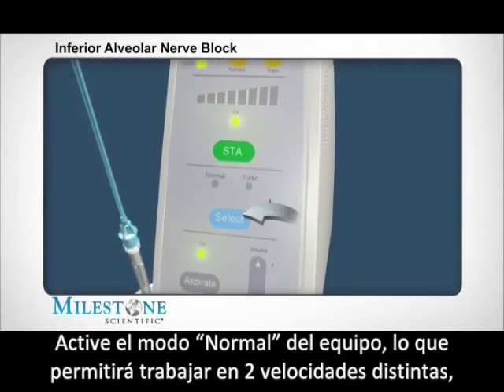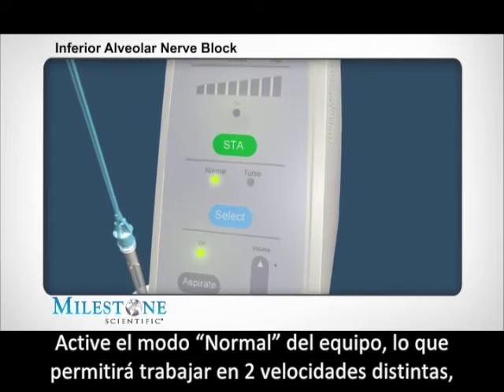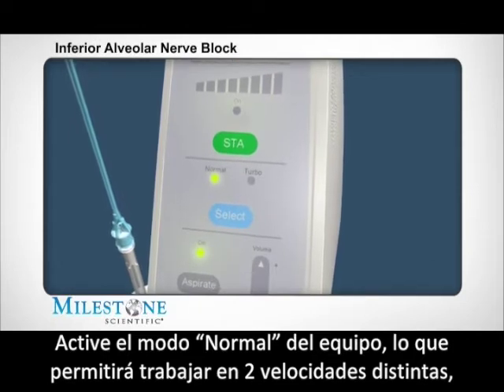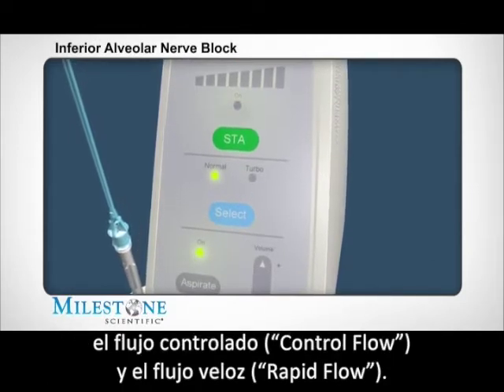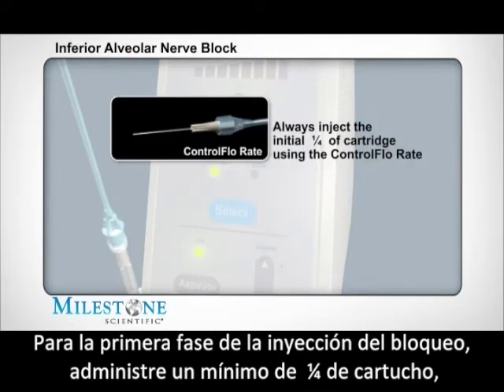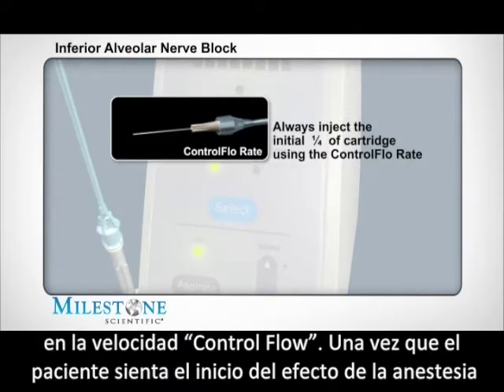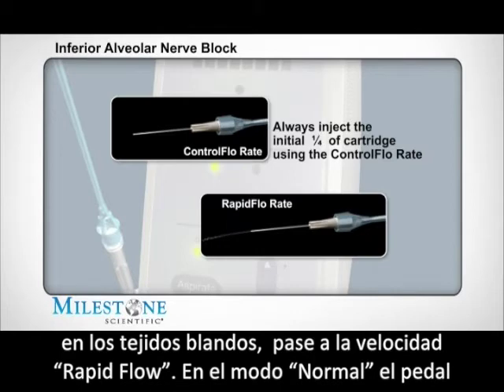Set the STA instrument to the normal mode, which allows the STA to function with two distinct flow rates: the control flow and the rapid flow rate. Utilize the control flow rate to administer a minimum of one quarter of the cartridge for the initial phase of the block injection. Once the patient feels the onset of soft tissue anesthesia, transition to the rapid flow rate.